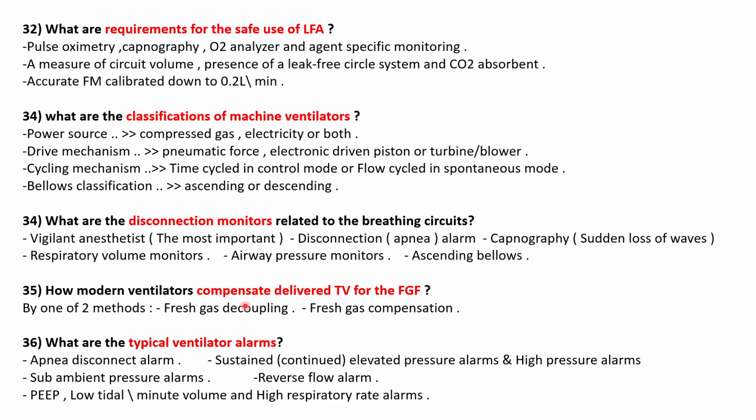How do modern ventilators compensate delivered tidal volume for fresh gas flow? By fresh gas decoupling and fresh gas compensation, and the most effective of them is fresh gas compensation.